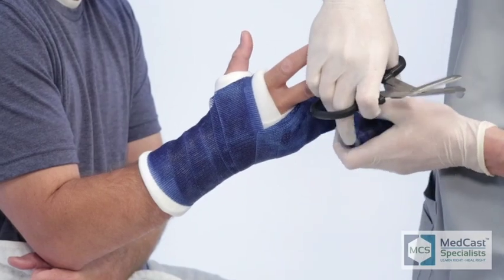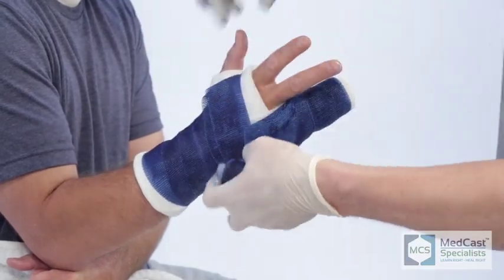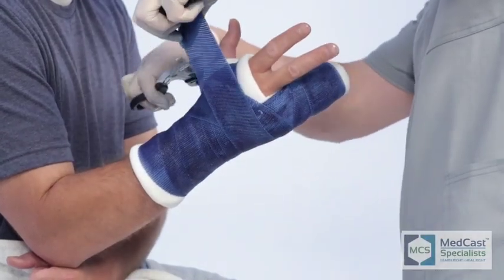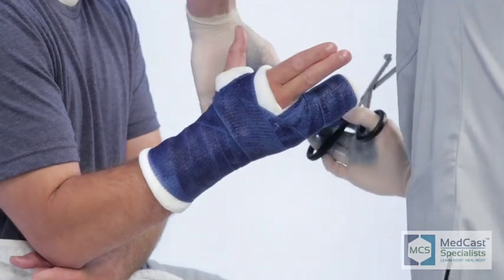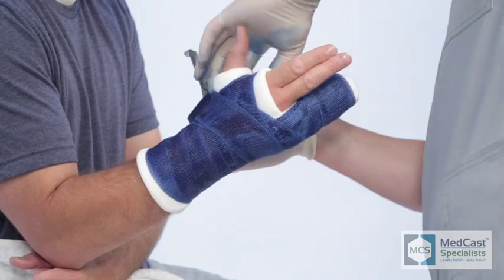Once you get to that point, you don't have to cut it — go around a couple of times to make sure you have a nice clean edge on the distal end. Come back up and catch as close as you can into the web space. Then turn, catch your angles, and catch all the wings you've left open. A lot of times you'll have enough cast material to catch that web space one more time, ending up with three layers through there, so the wings don't fold back up on you.